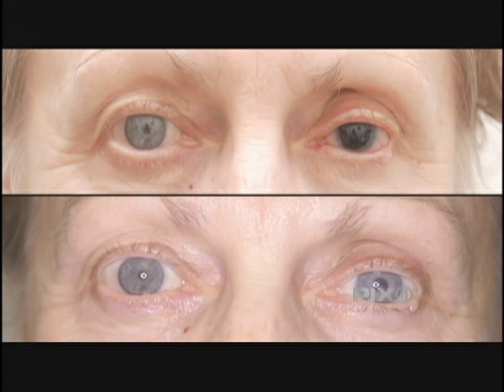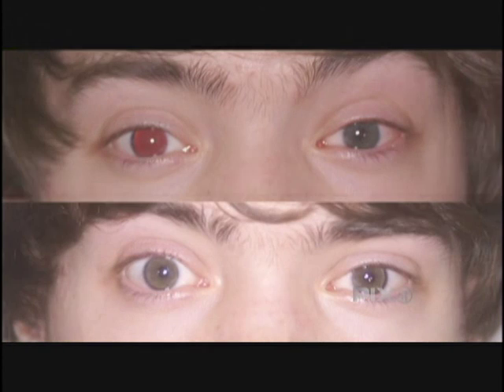So we went ahead and put an iris prosthetic implant in her eye. We took a photograph of her other eye, matched it perfectly, and it was hand painted and then implanted in her left eye. I mean, that's astounding, because when you look at her in the bottom, which is the after picture, it's like a normal eye. Completely normal. The technology is astounding, an ability to reproduce a normal appearing eye.